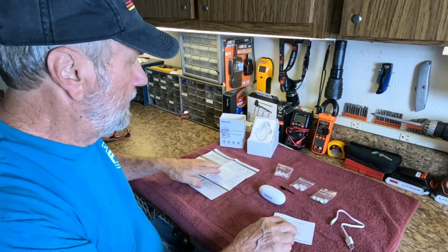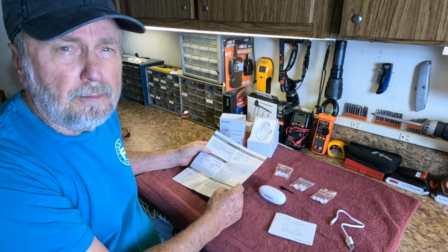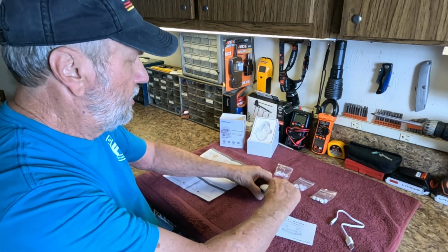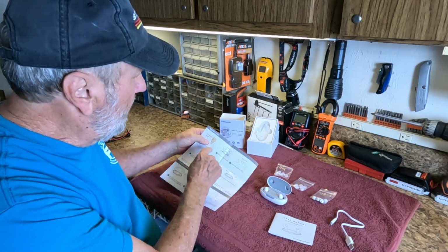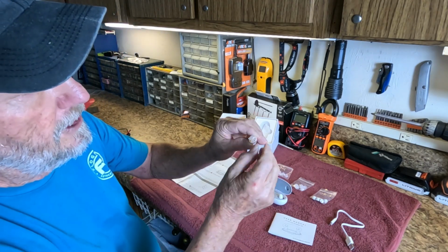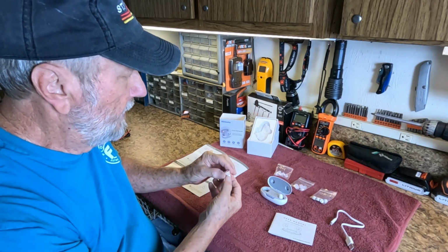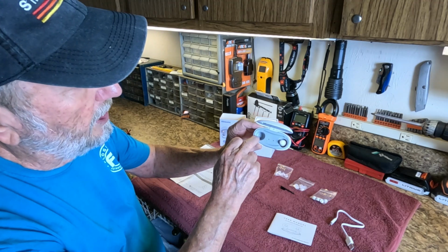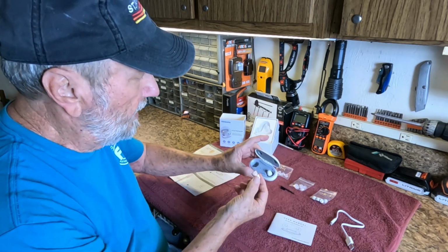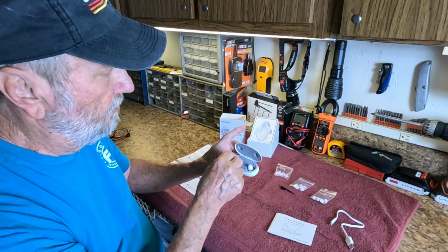Now, we're going to look at the first steps when you get the product. It's charged up and you want to get into operation real quick. What you want to do is look at the operational chart. Each of these earpieces will have a little insulation tab on them. Mine is already taken off. It'll be on the back side and you just peel it off. What it's doing is covering those contacts on the back, which we'll see in detail later, and this is how it's charging. In the bottom are three little contacts that match up with them. So you do have to orient this correctly to place it where the contacts are in contact with those down there, like this. And then it'll start charging.